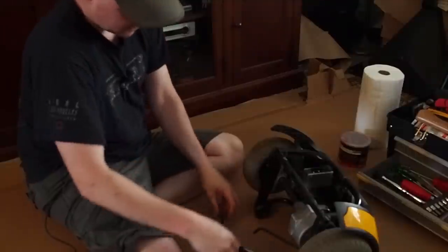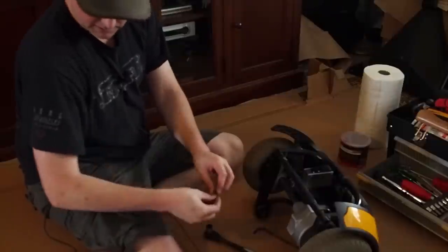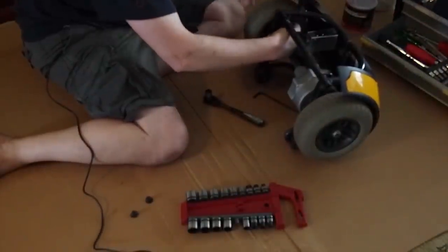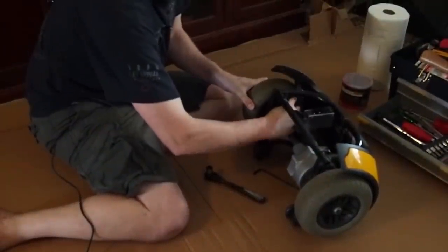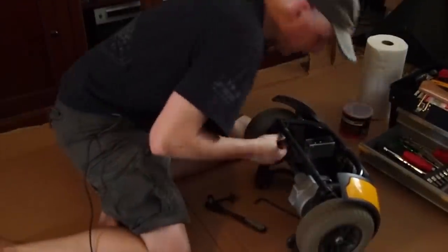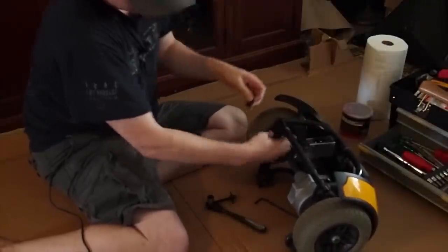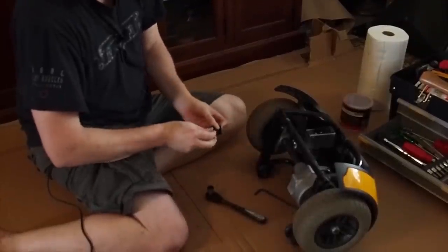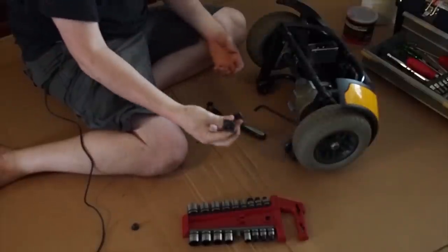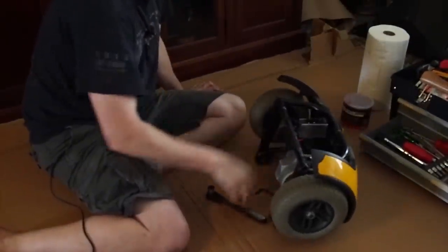Now, what I normally do is I like to keep all the pieces together, so I'll keep my screws and washers together, and I'll pull out the whole screw assembly. I'll pull out this whole assembly, and I'll even take out the rubber grommets, and I'll just put them all together, so that I have everything together like that. And I'll have four of those in a moment.